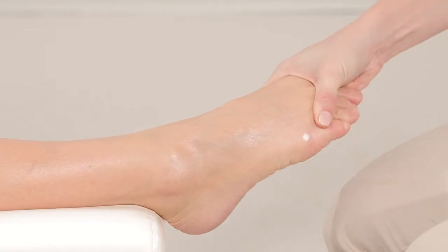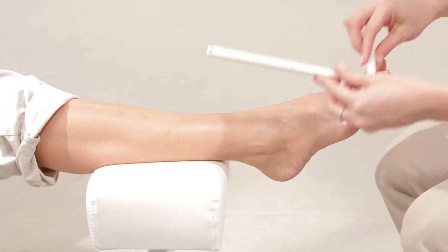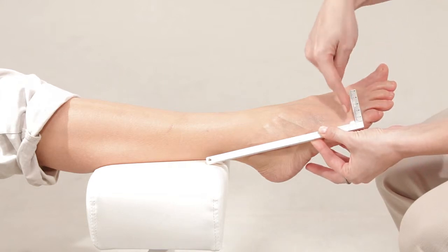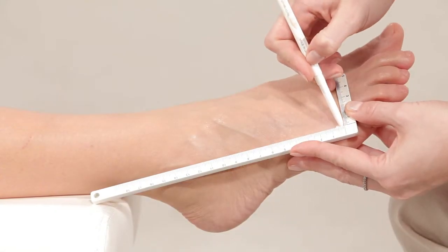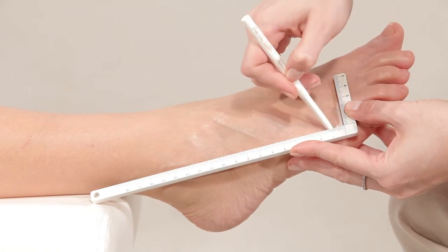The toes can now be released. Place the measurement gauge on the foot with the internal corner of the gauge placed on the dot. The short scale should be parallel to the toes and the long scale parallel to the measured bone attached to the lateral malleolus. Mark two perpendicular lines along the gauge lines with the pre-marked dot as their meeting point.